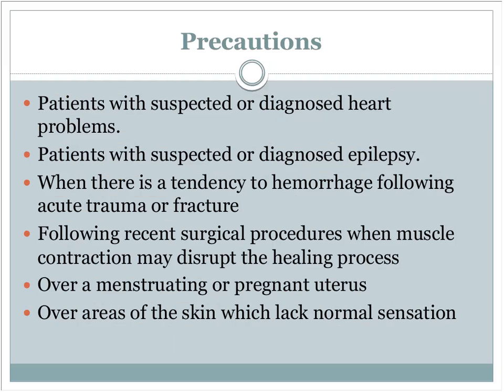Here you go. Now, the last one said there's no safety that's been talked about, and that's under the contraindications. But it said there's no safety talked about, not that you should not do this. So it's a matter of semantics. Here it's saying you need to be careful about it. And in this case, what I'm thinking more along the lines of is pregnant lady low back pain. I've done it. There's been no problems.